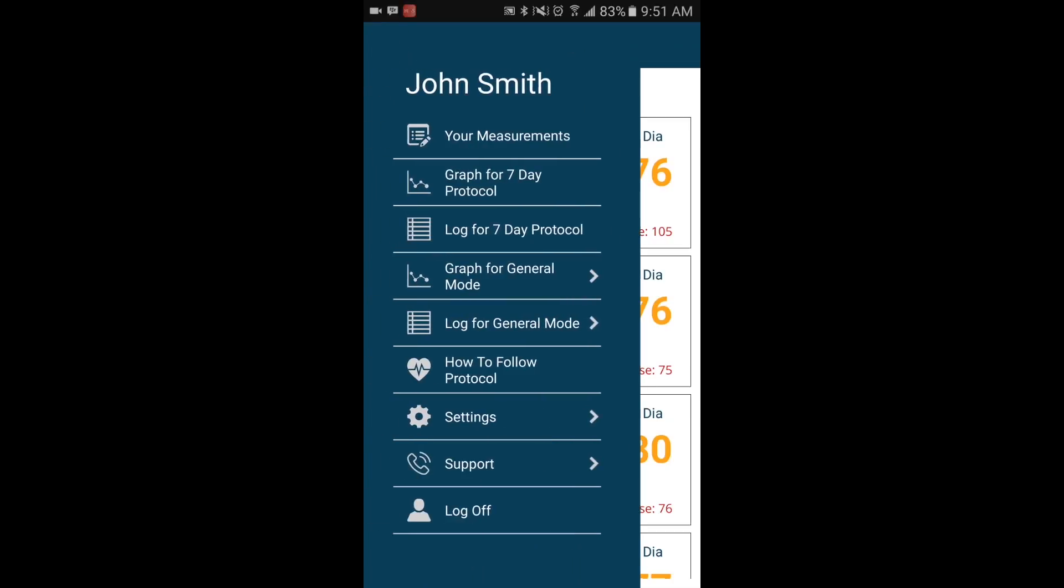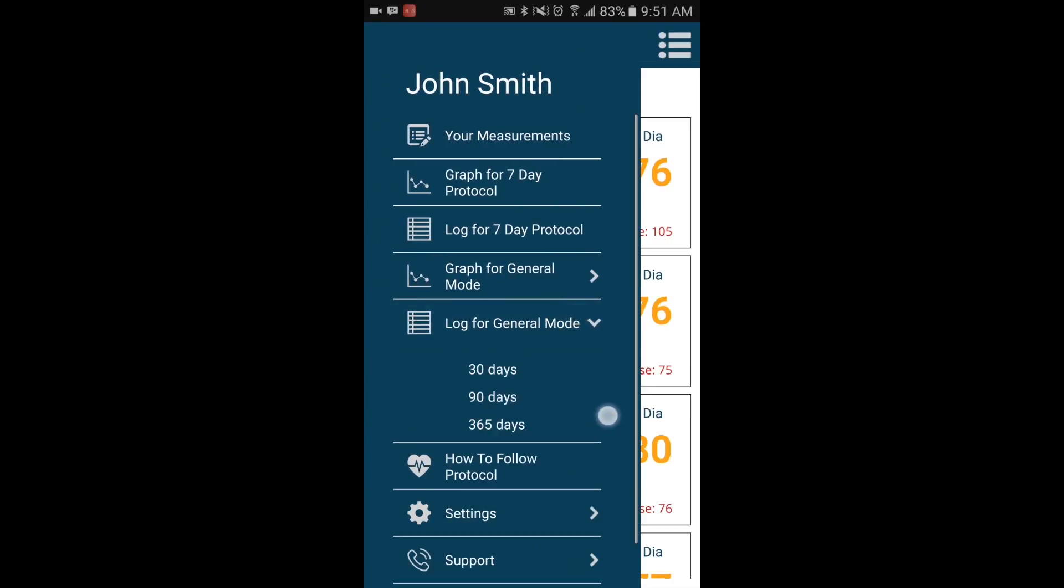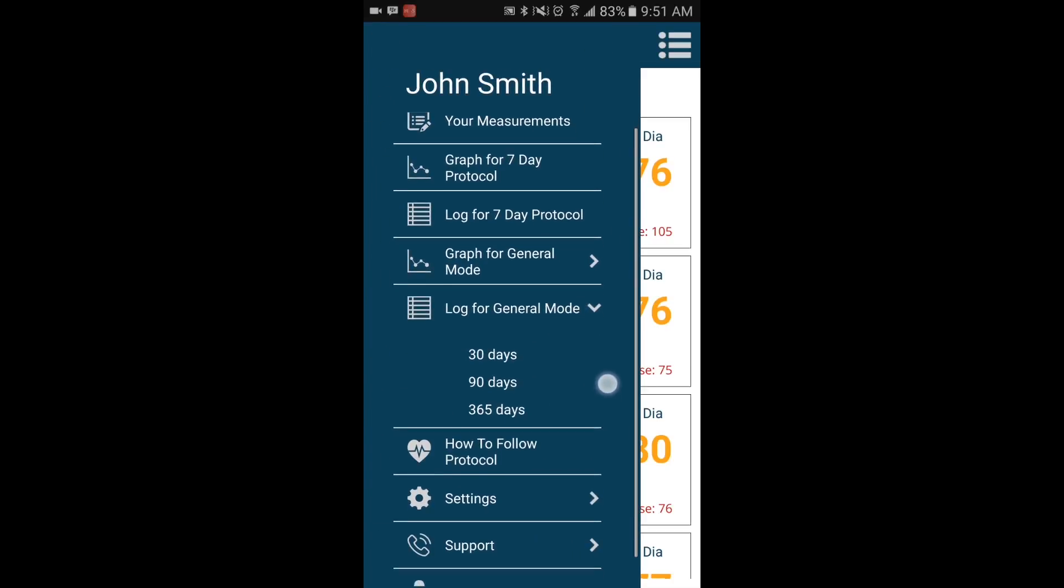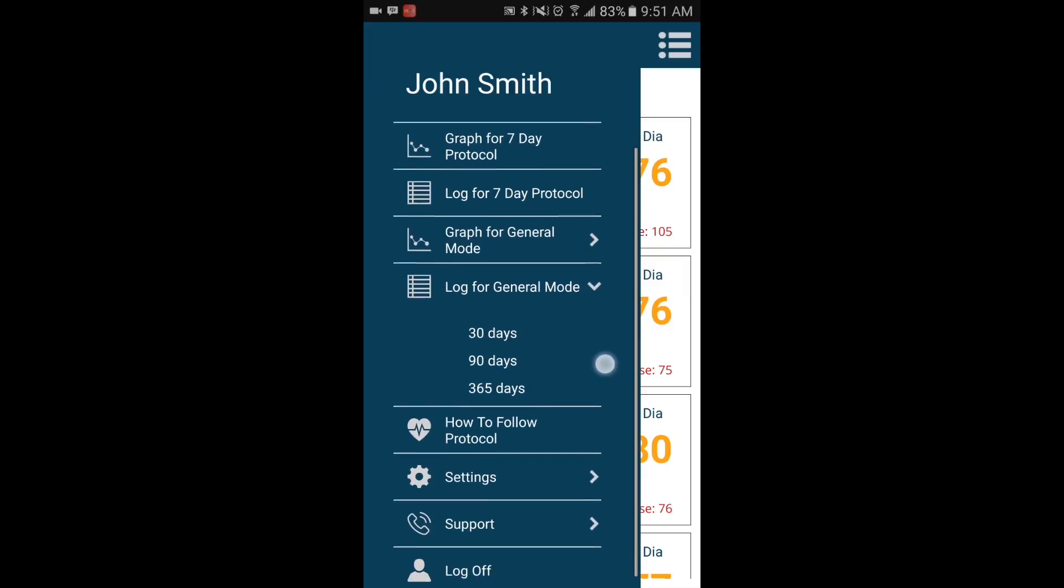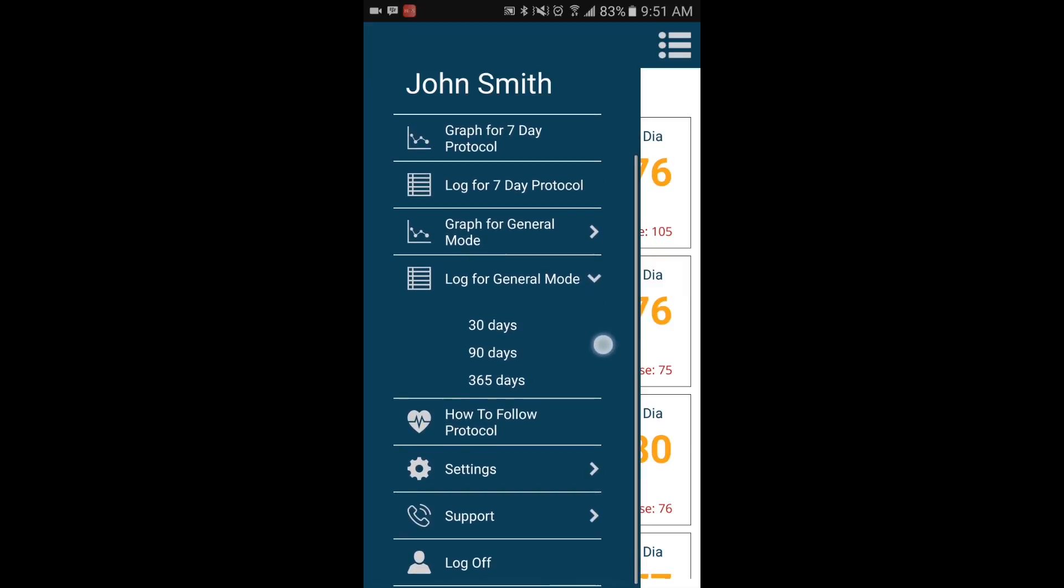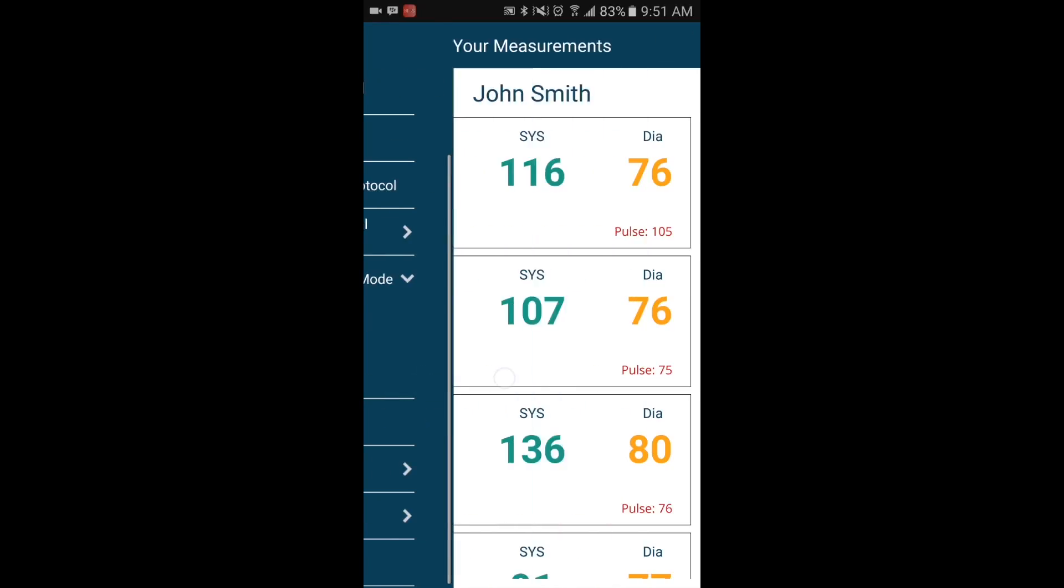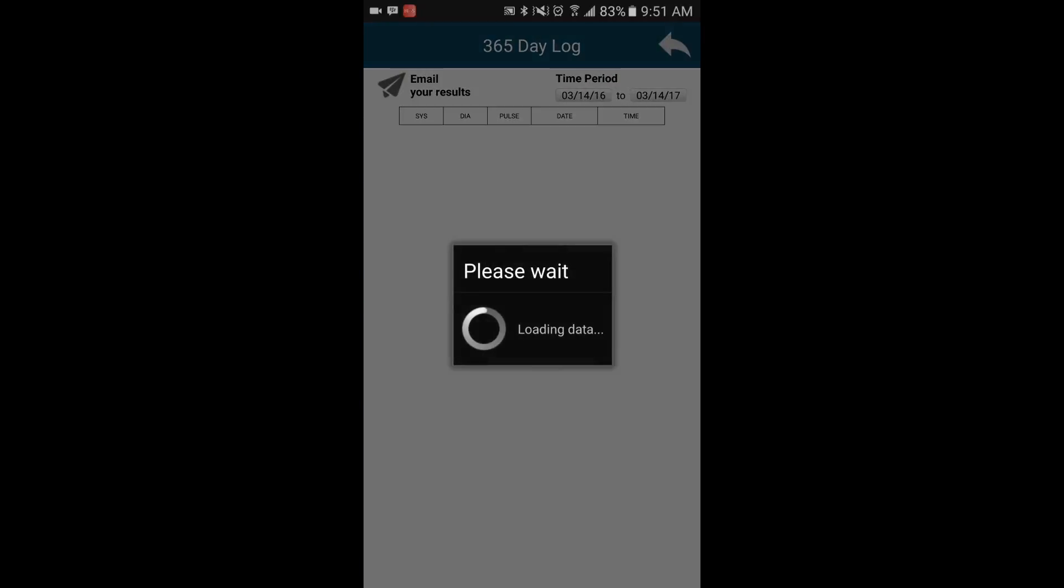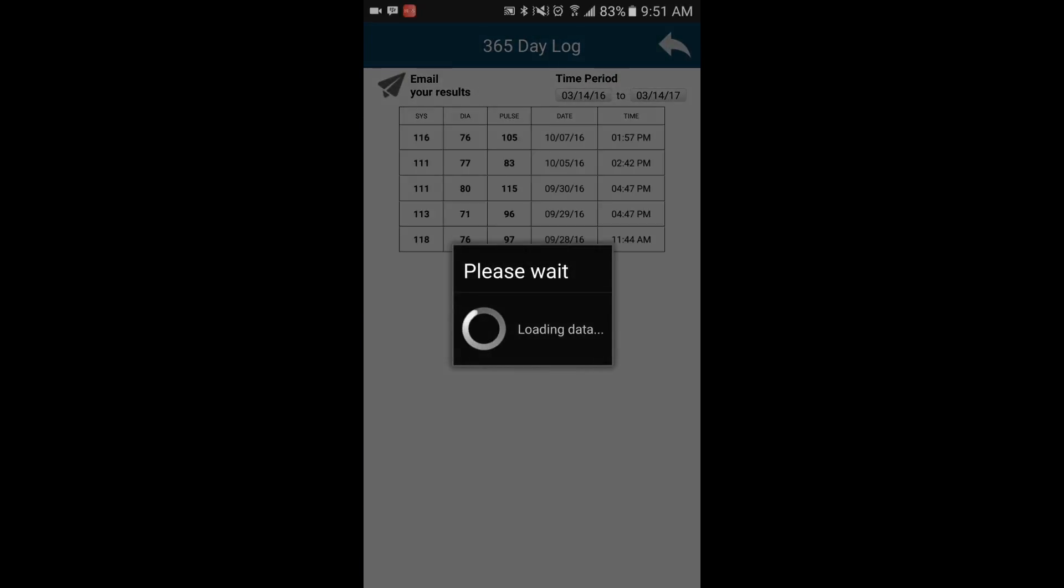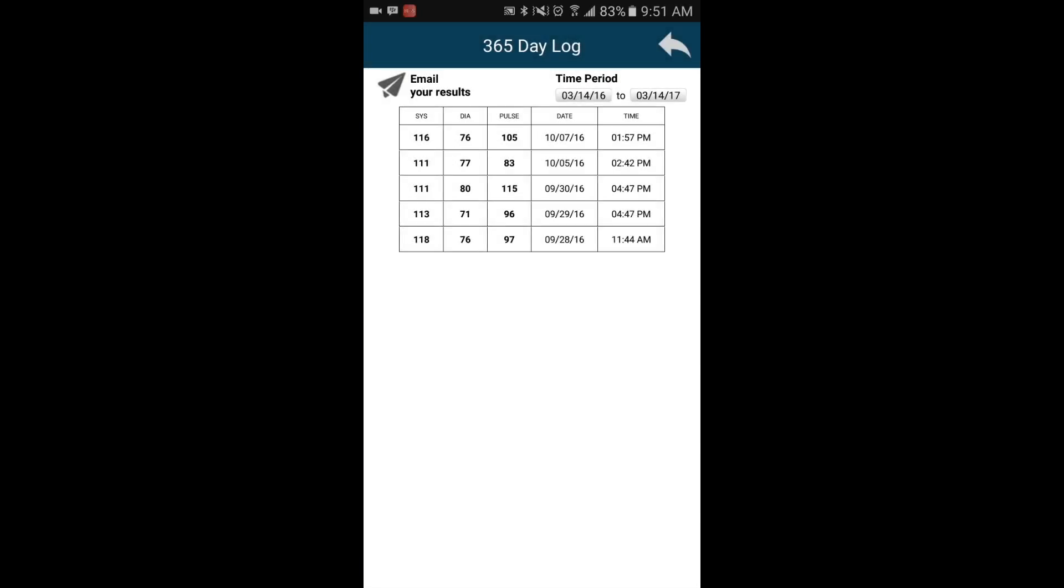You can view all your measurements in a graph form or in a chart. You can choose to view your measurements for 7 days, 30 days, 90 days, or 365 days.